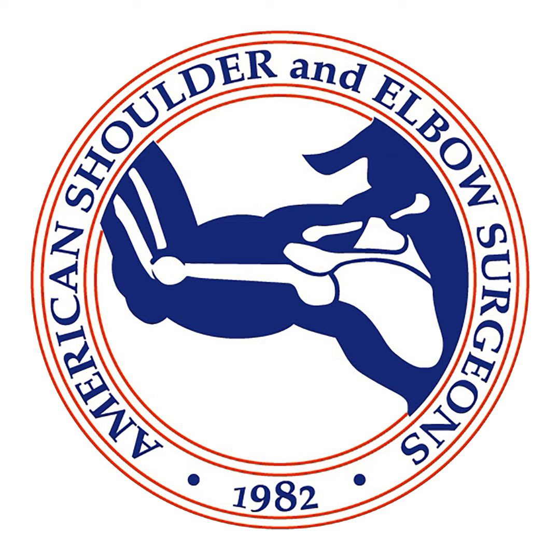Okay, so let's start at the beginning with our go-to workhorse style humeral component historically, which has been the stemmed component. So, Dr. Sperling, tell us, what are the advantages of a stemmed humeral component? Well, there's no doubt there's a long track record of success with stemmed humeral components. So if we look across the board, the rate of isolated humeral loosening has been extremely uncommon. There's been a lot of evolution, obviously, from cemented to uncemented designs, and we've gone to shorter and shorter stems. And throughout all of this, thankfully, the rate of loosening has been uncommon.